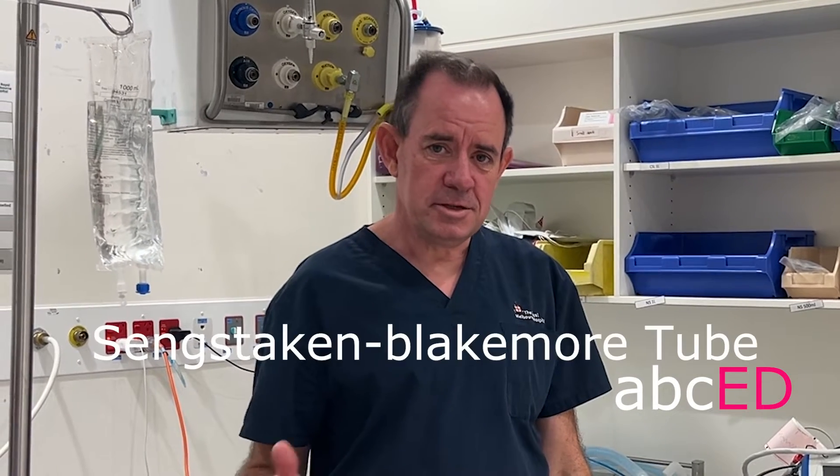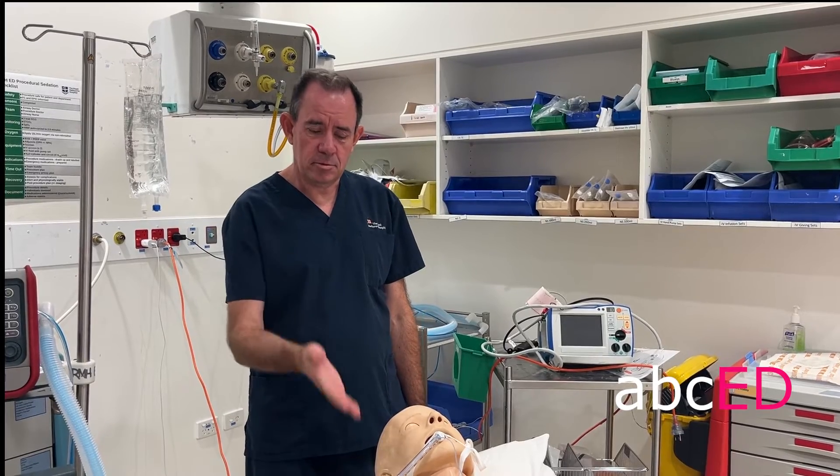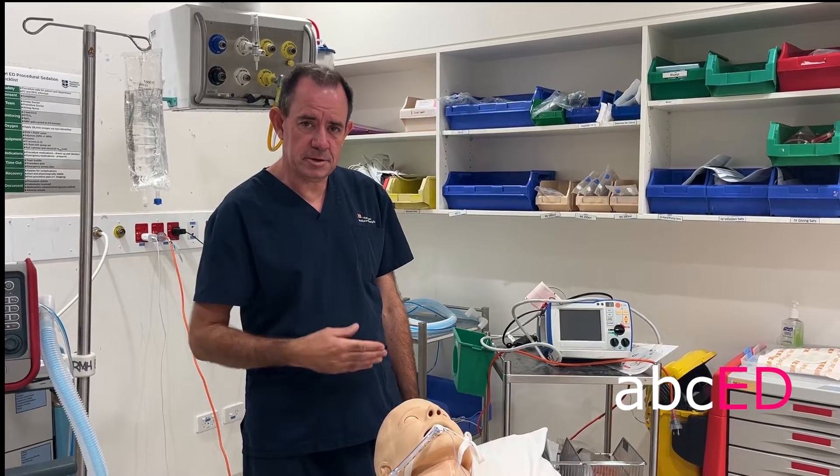Hi, it's Jonathan, welcome to abcED. Today we're going to do Sengstaken-Blakemore tube insertion, and this is for critically unwell patients. Your patient will be intubated before you start, and have them head up to 30 degrees.